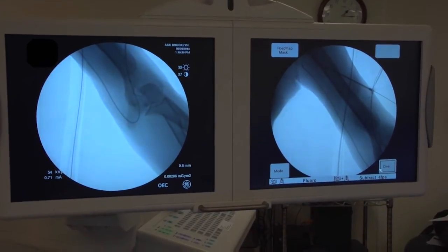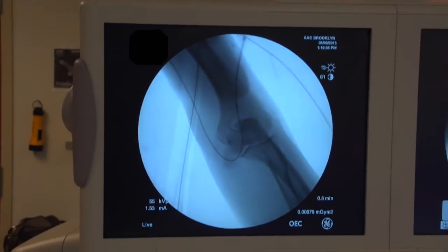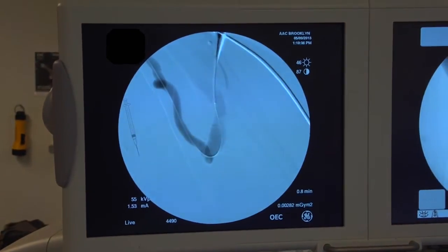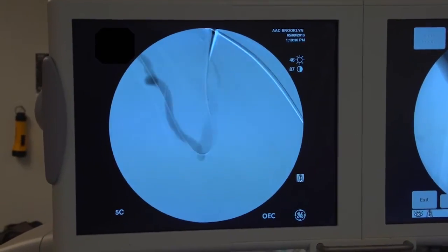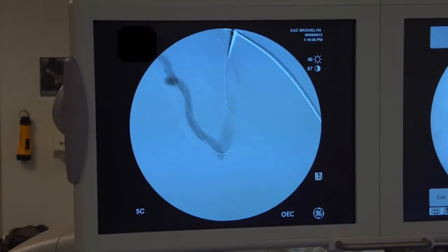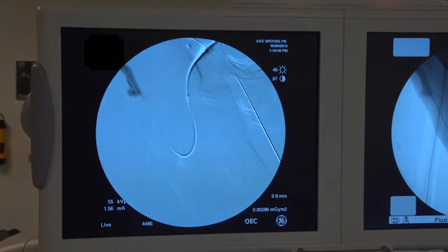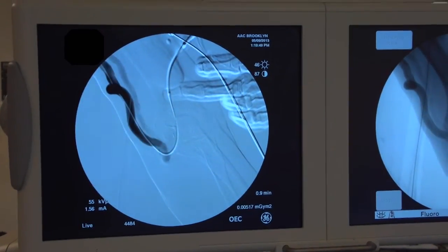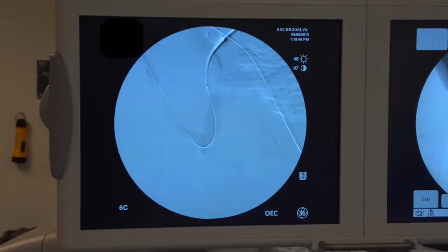You can see the patient has a large dilated hypertrophied artery. In this case the patient has a high-origin radial artery connected to the fistula. In this image, flow is coming down the artery and you don't see any flow bypassing the access, indicating the patient has a relative steal syndrome. In the next image I am compressing the fistula, and you can see the brachial artery adjacent to the radial artery which then perfuses the forearm and hand.